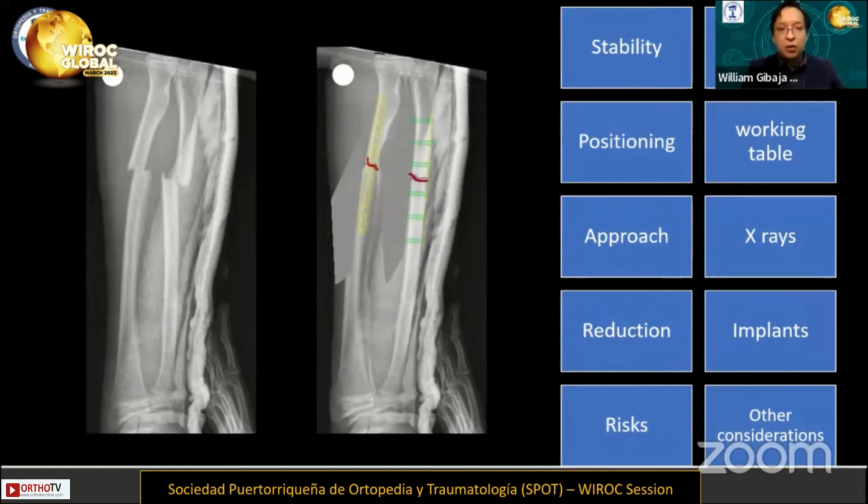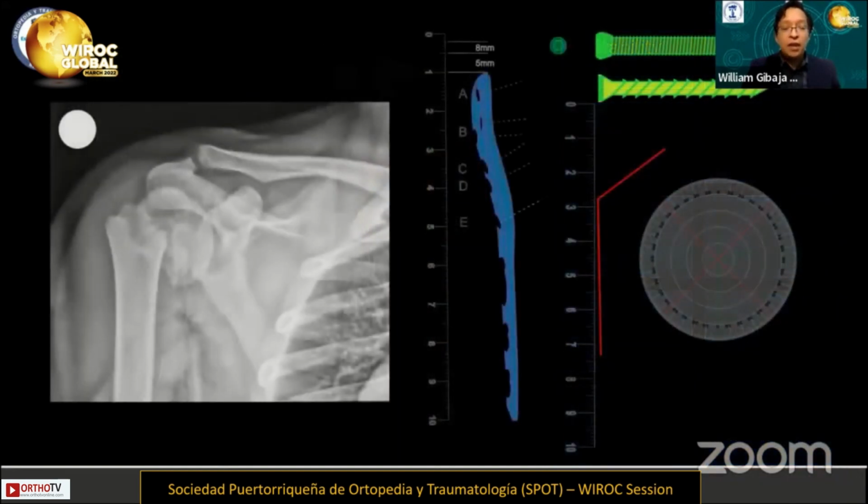You see this small white ball that is our frame to do the application and the sizing of the implants. And also we wanted to do a bit more, because every time we face something new, we look for more problems that we need to solve. So this is a Philos plate. Not only in our designs we use the implant, but also the directions of the screws, the height of the tip of the plate where we want to place that in.